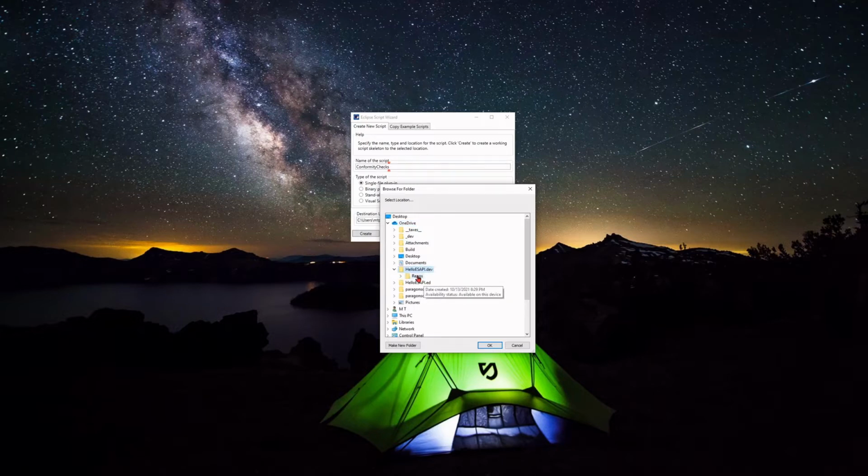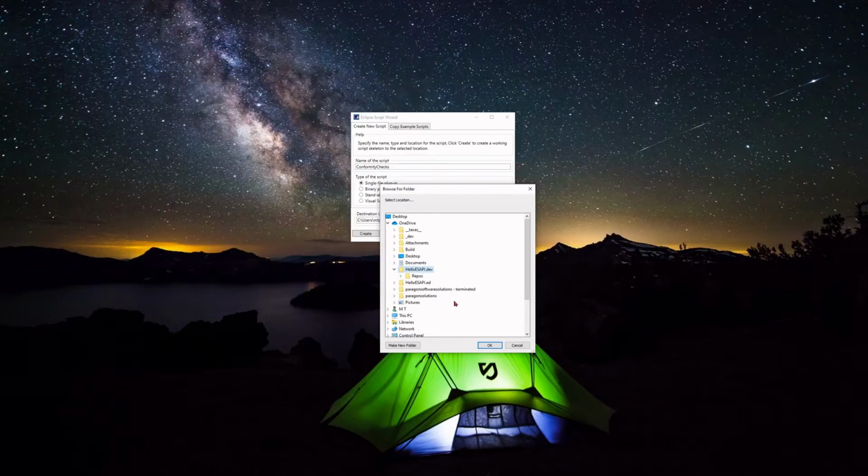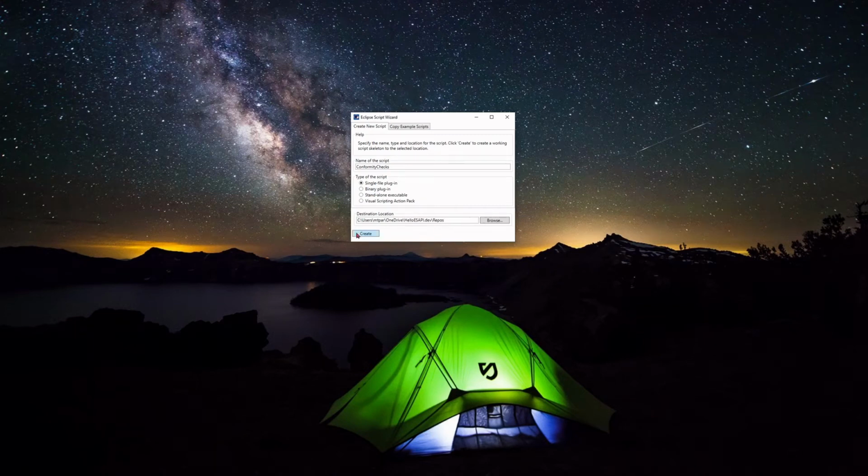And if you remember, eventually what I would like to do in this video is create a GitHub account. Depending on how long this video winds up being, we might do this in another video, just to split it up, but we'll see how we go. So I'm going to create it in this folder, and then eventually I'm going to turn this folder into a GitHub repository, so that it can be managed by the account. So anyway, I'm going to create it here, and I'm going to go ahead and launch Visual Studio 2019. I can close this.